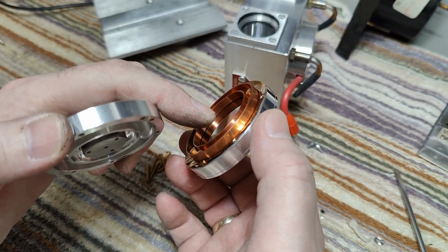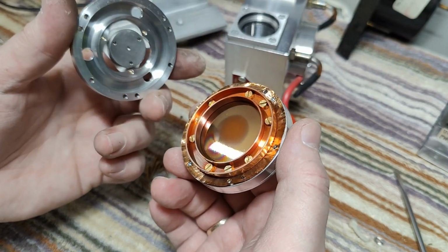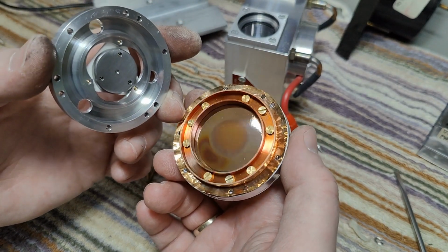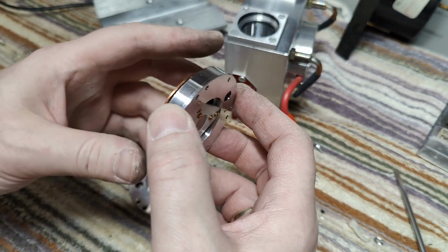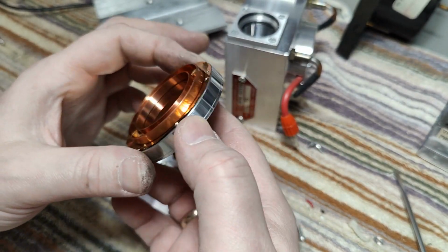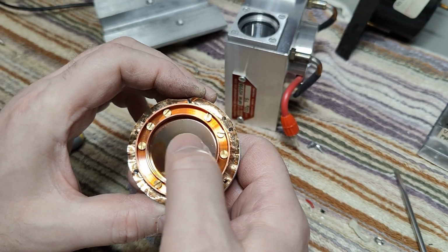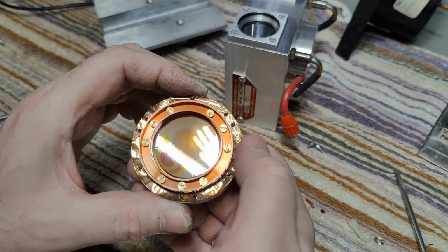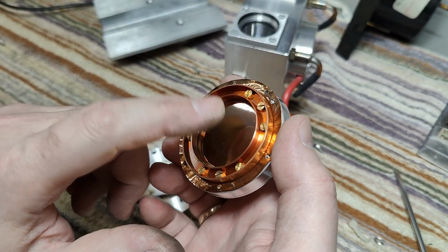And see, when this one moves, this system can measure this. So how is this detector measuring CO2 by a microphone? That is something that I haven't yet understood. But that is what this is. Now I can of course touch it because I'm just gonna save it for later probably. But there's this membrane, see?